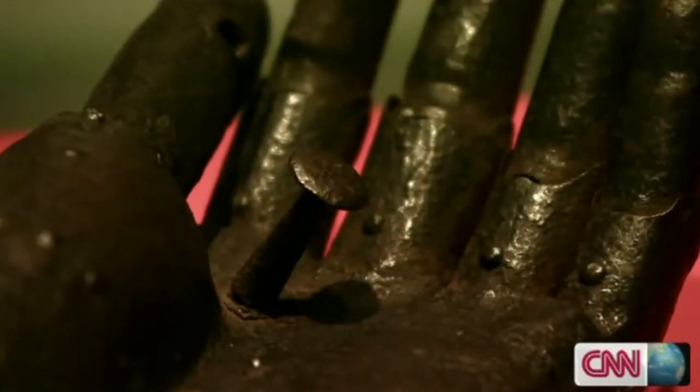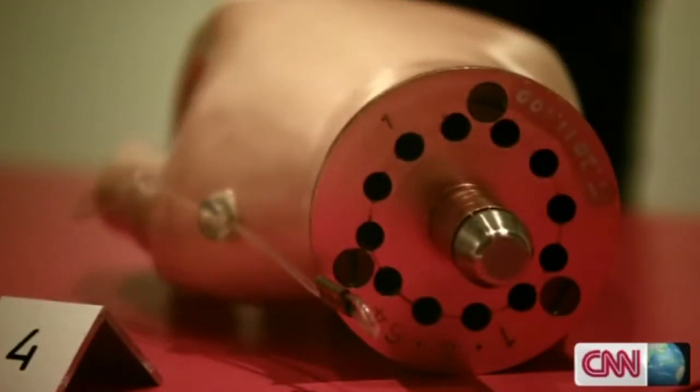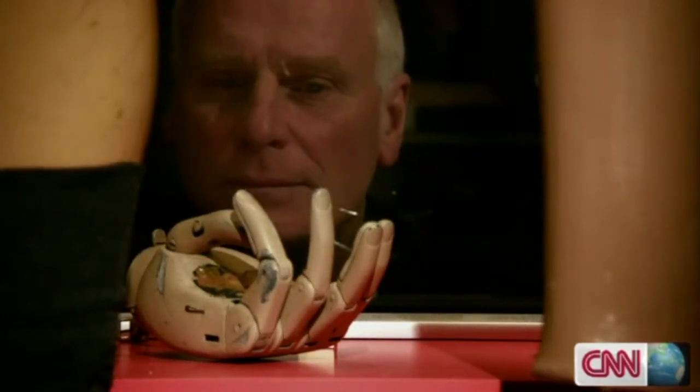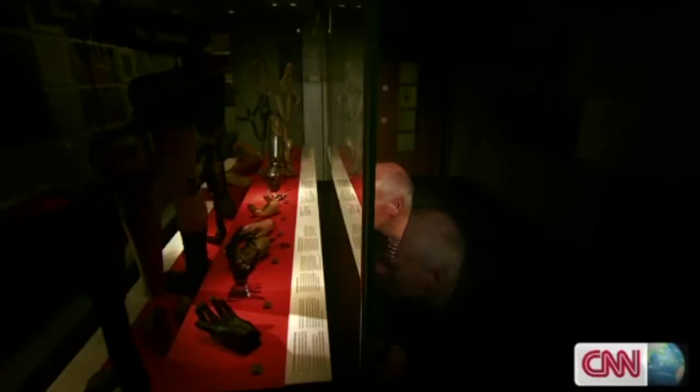We've used a whole variety of materials to make artificial limbs in the 20th century. These days the science has made a great leap forward. Prosthetic hands are now able to do pretty much what a real hand can.